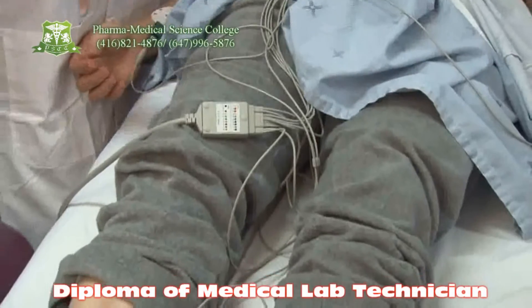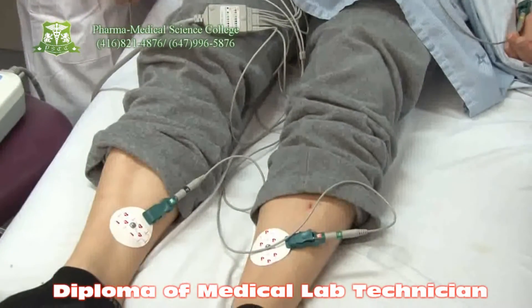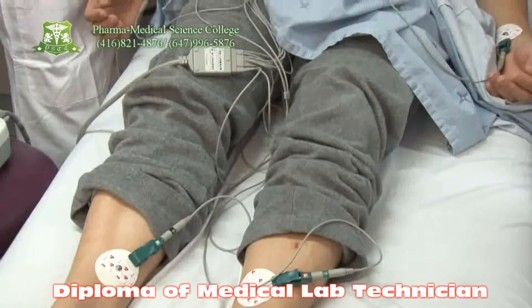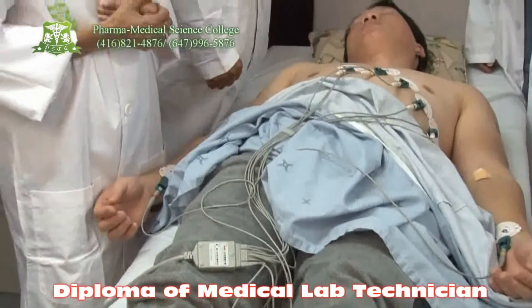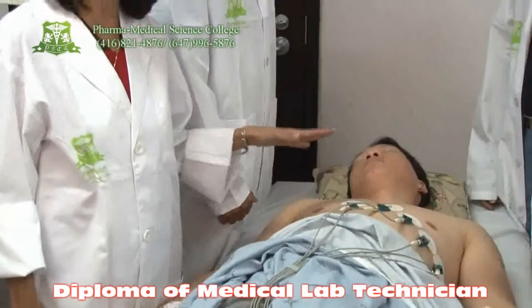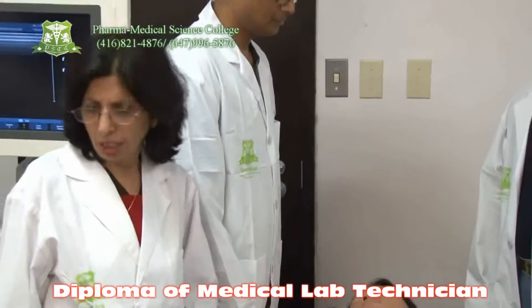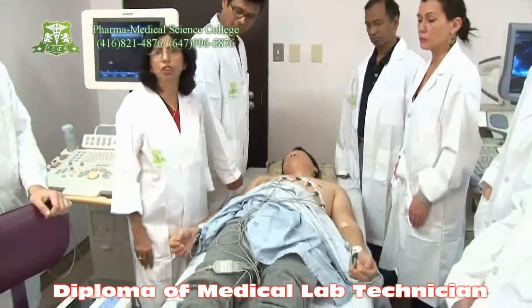Once the electrodes are in position, ask the patient to lie in a standstill position — no movement. It's very important to record an exact ECG recording. Also make sure the patient is not carrying any piece of metal, like no chains, no earrings, nothing which would interfere with the ECG recording. Then press the button which says start and it will begin printing the ECG.